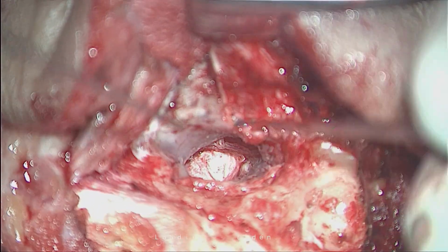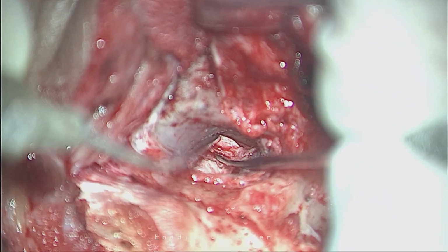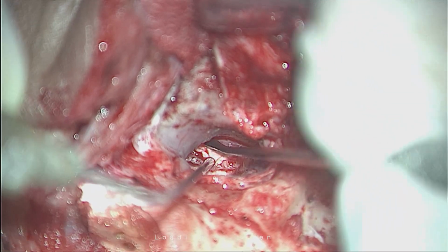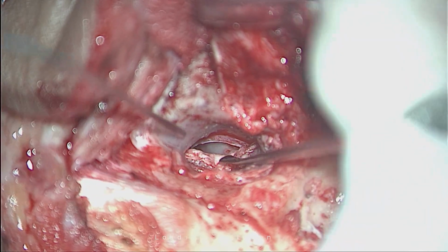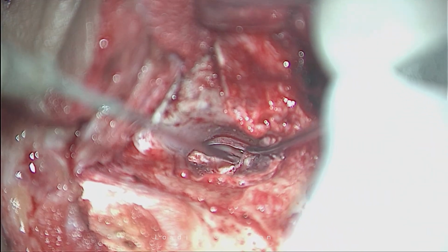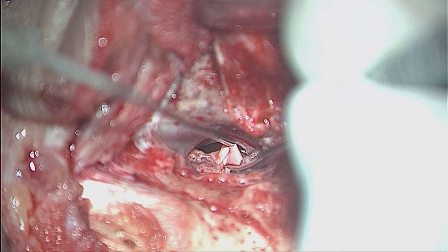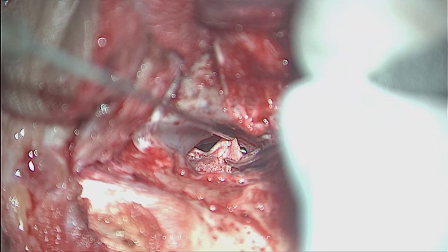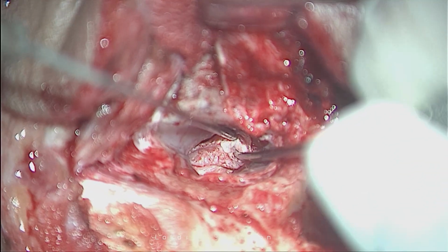Now coming anteriorly and anterior superiorly, it is the same thing. See, my graft makes one unit with the flap. See my mucosal layer below. And this graft is going to sit on the mucosa without any tension. We don't want this graft to be under any tension.